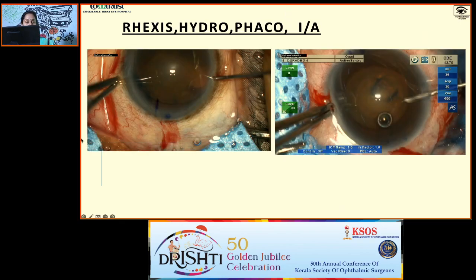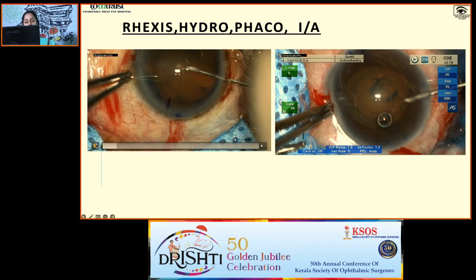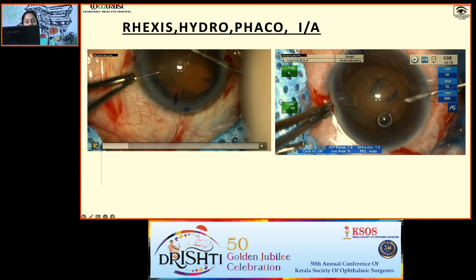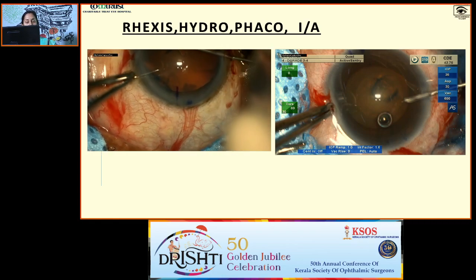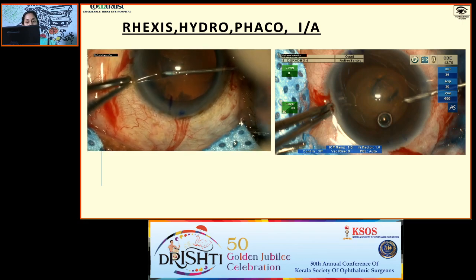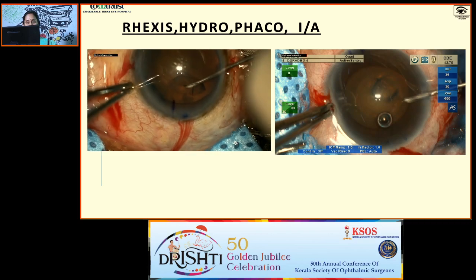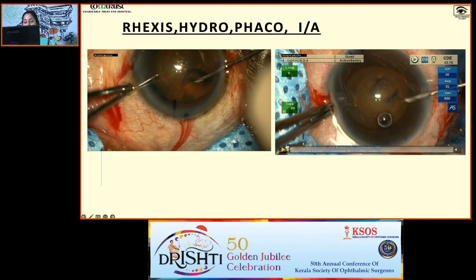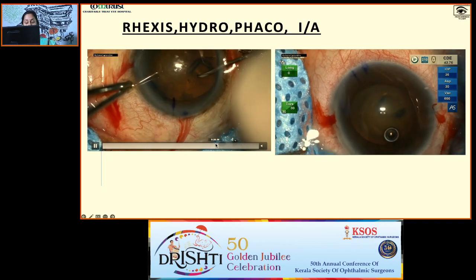Rhexis is just like any other case. Do a 5 to 5.5 mm rhexis. It will be covering 1 to 1.5 mm of the periphery of the lens, and it will be giving a proper centration of the lens and will prevent rotation of the lens. After completing the rhexis, for hydro, it's a routine hydro. You can rotate the lens.